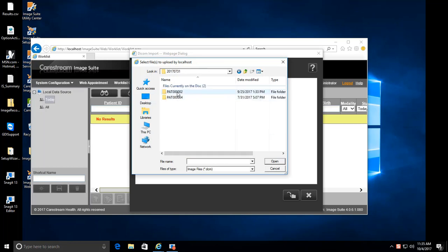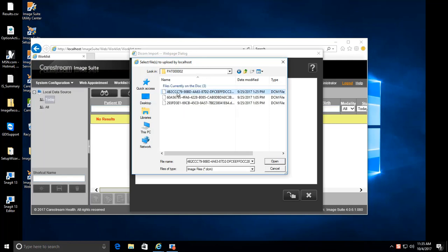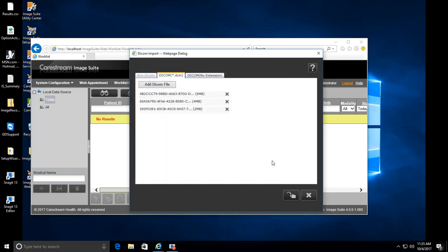Double-click on the folder you wish to import, then double-click on the Patient folder you wish to import. Select the images to be imported, then click Open.